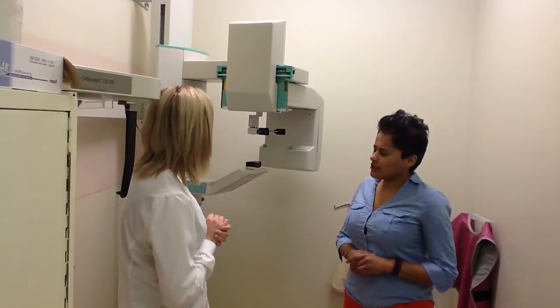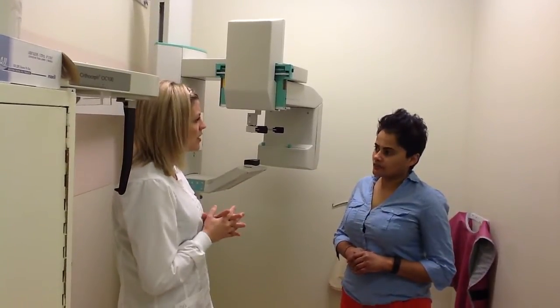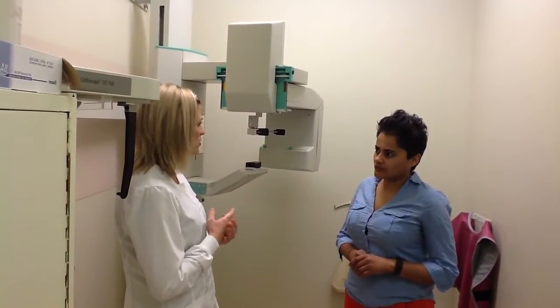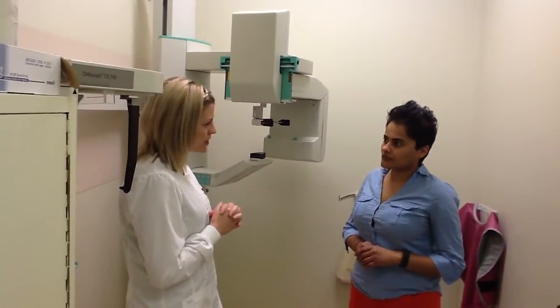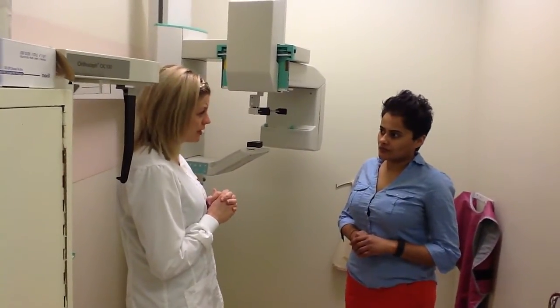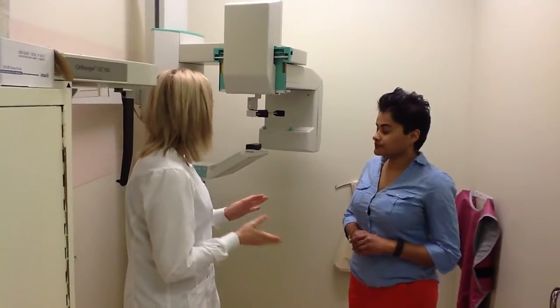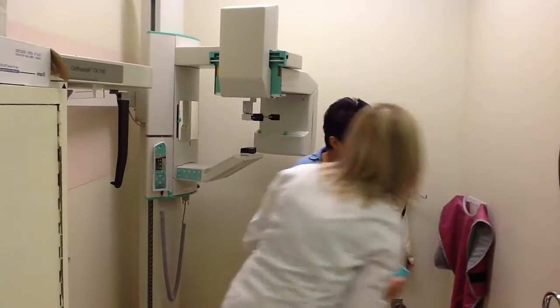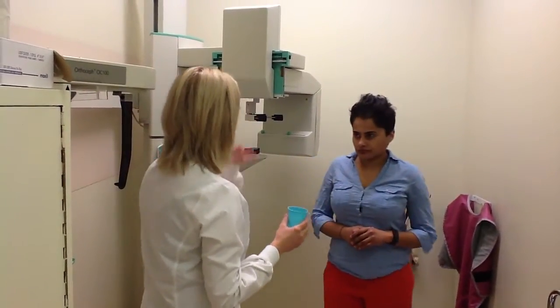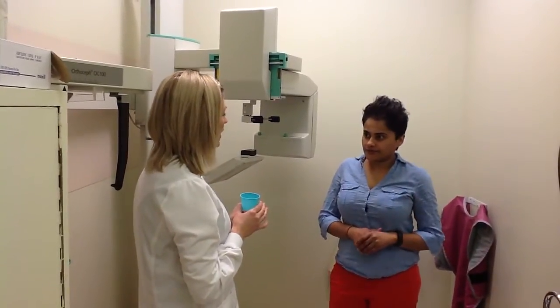Okay, sure. How often do I take this? This can be determined, it's individually based. There's no requirement that every patient needs one every year or every 5 years, but on average it's about 3 to 5 years. Okay, do you have any questions? No. Okay, so before we begin, I'm going to have you remove any jewelry that you may have from your shoulders up, or any metal hair ties. I'm good.